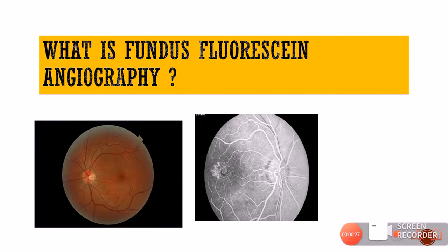So what is meant by fundus fluorescein angiography? The FFA is a diagnostic technique that allows the sequential visualization of the blood flow simultaneously through the retinal, choroidal and iris tissue as we put a fluorescent dye into the bloodstream via the vein of a patient. This fundus fluorescein angiography is based on the principle of fluorescence.